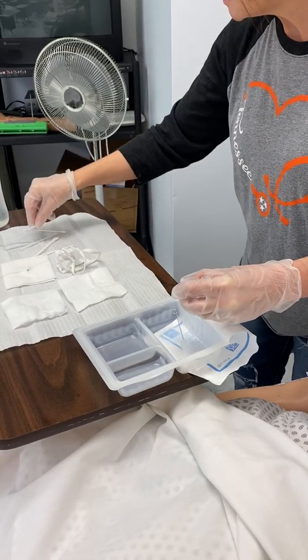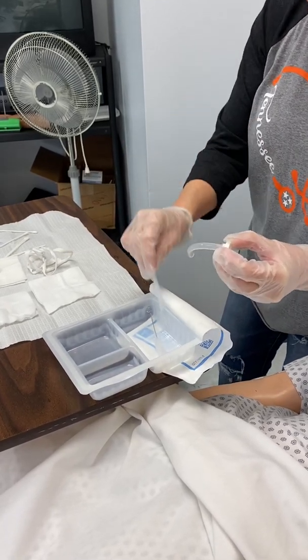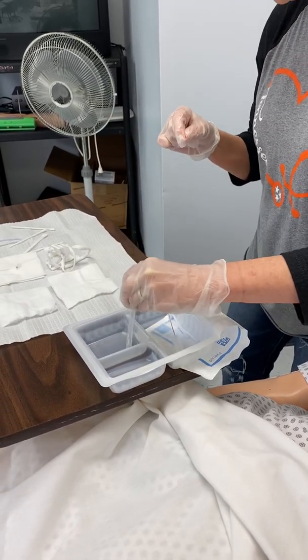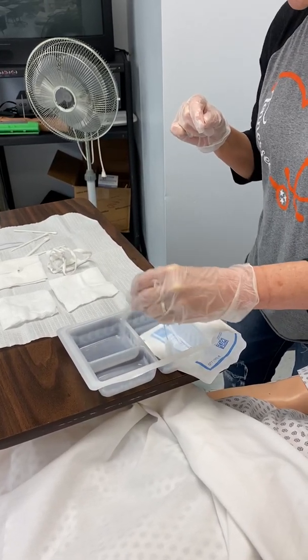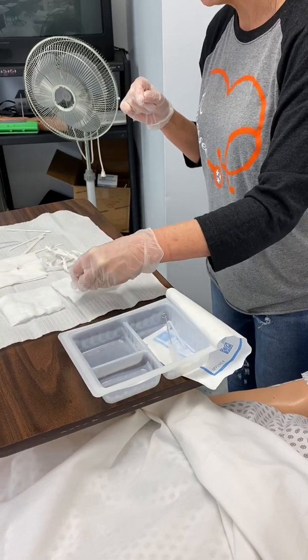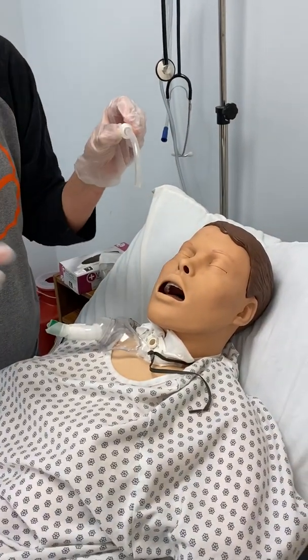If you need to take the pipe cleaners, you can. Clean down in it. Just leave it in there. You don't want to lay them back on your sterile field if they're dirty. Then I'm going to dip this in my rinsing to rinse it. I can tap it, or I could dab the excess droplets of the normal saline onto this, okay? Then I'm going to take it, still, I have to only touch the white part.